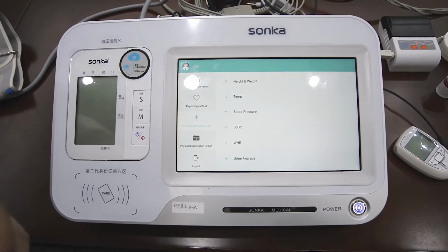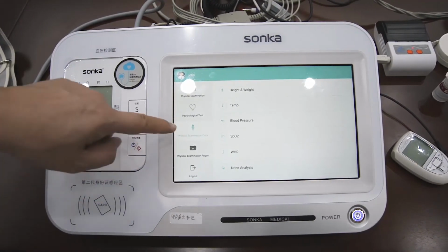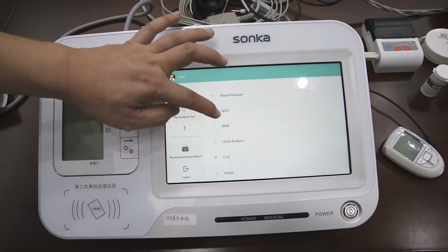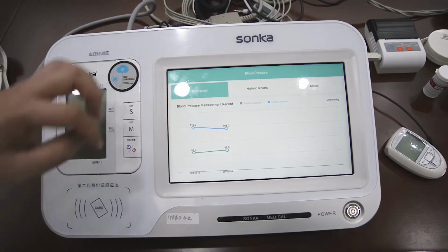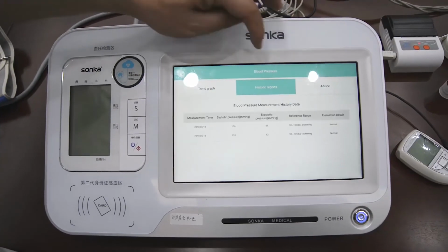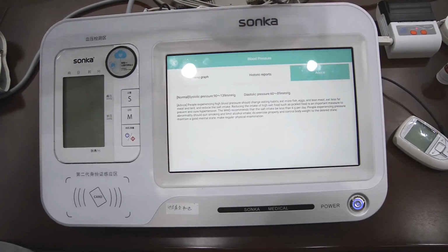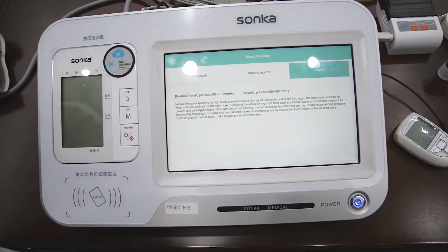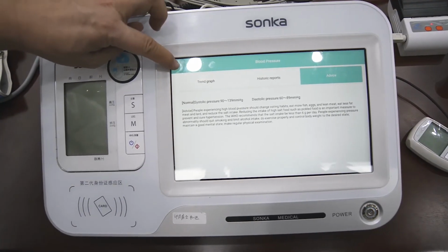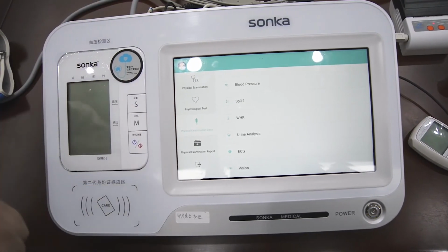After all the tests are finished, we can go to check our previous history. Here we press this button and you can choose any item, like blood pressure. You can see your trend graph and your history data, what your previous data was. And this one is some advice on what you should notice in your future life. Okay, this is for the history report.